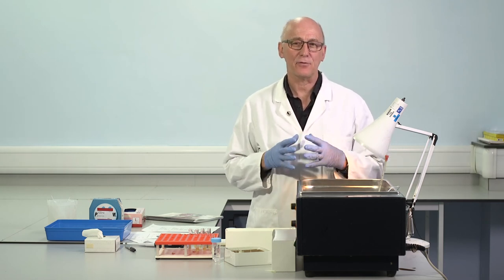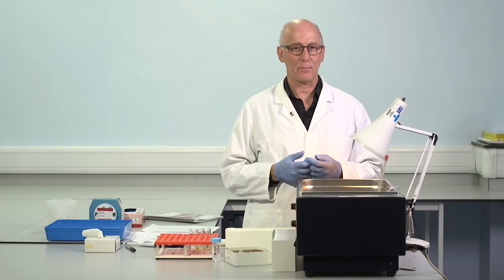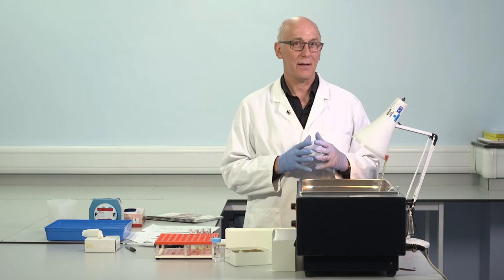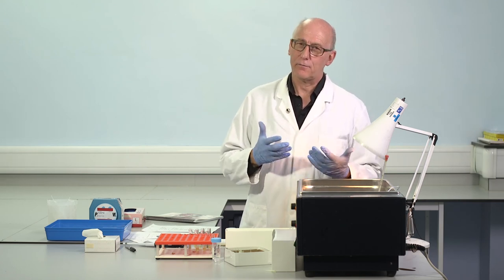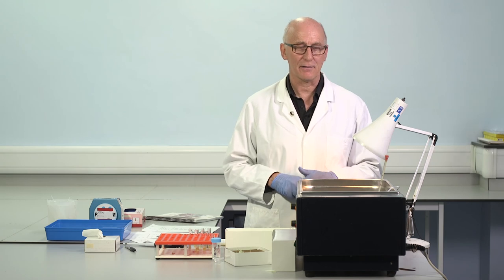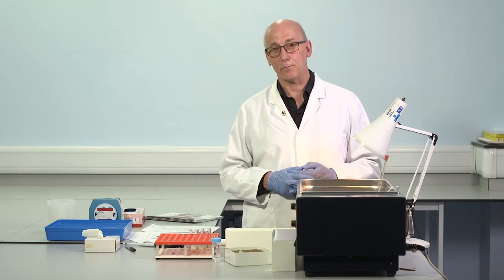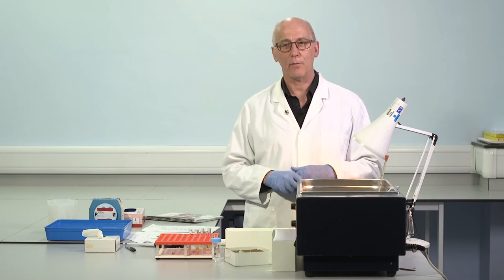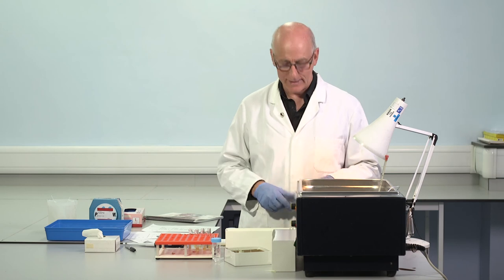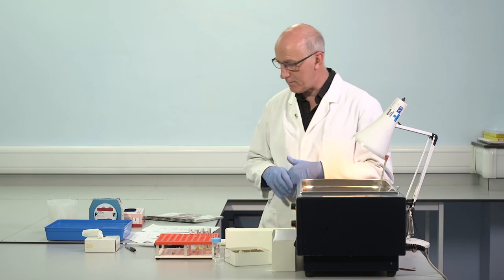So in my opinion, it's absolutely essential to have robust checks in place to detect hemolysis and to reject such samples and not to test them for APTT, unless we believe the hemolysis has occurred actually in vivo in the patient. From time to time, of course, this will occur: transfusion reaction, autoimmune hemolytic anemia, sickle cell crisis. There are some occasions. But the vast majority of blue top citrate samples arriving in the lab with visible hemolysis, it's an artifact, it's occurred in the sample, and that sample should not be tested. We will absolutely see an impact on the results, an important impact.